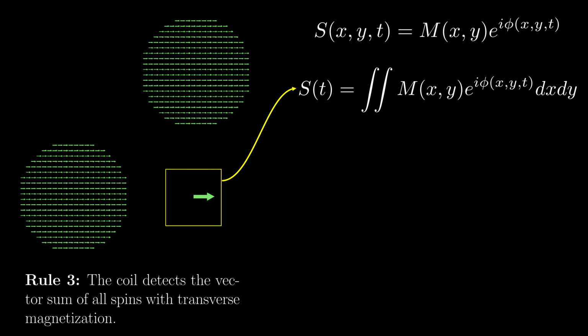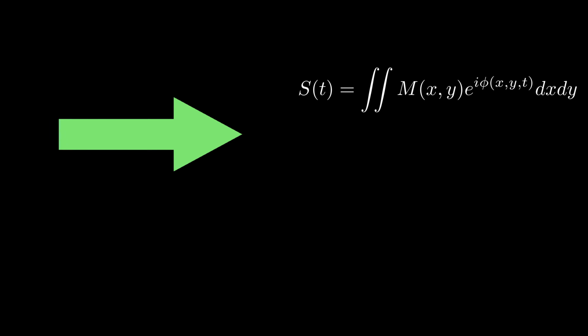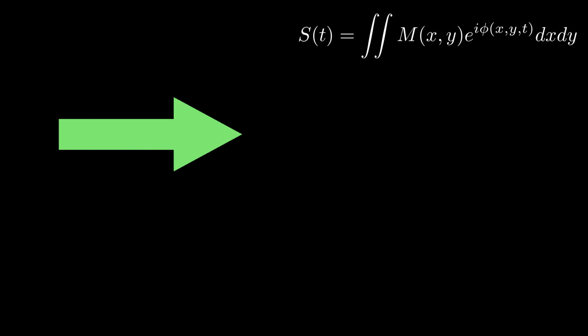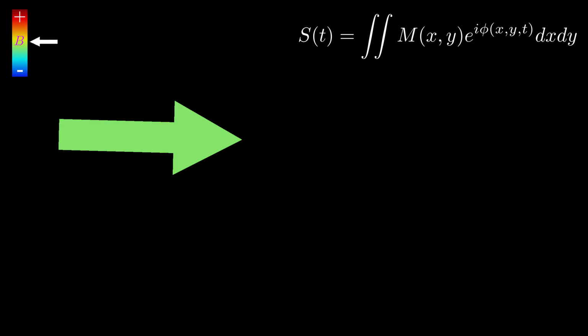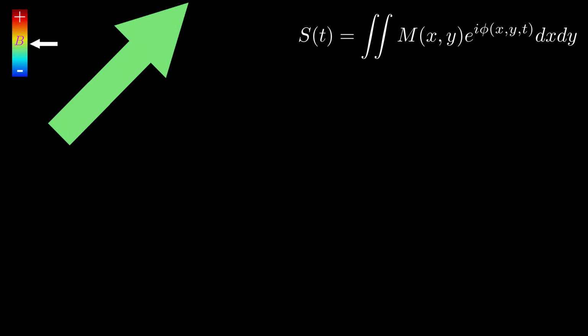The only way this is a Fourier transform is if variables x and/or y exist in linear form somewhere in the exponent phi. So, what is phi of an individual spin at some location xy? If we're perfectly at Larmor resonance, the spin is perfectly stationary in the rotating frame here. But in a higher field, the spin will accumulate phase and in a lower field lose phase.